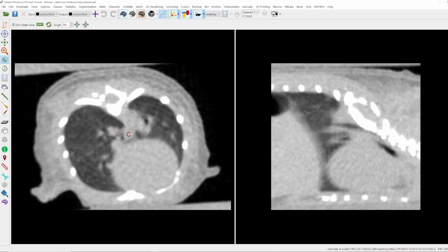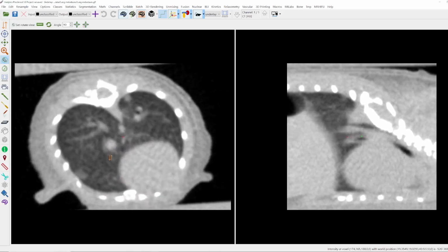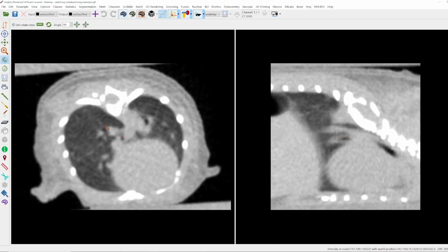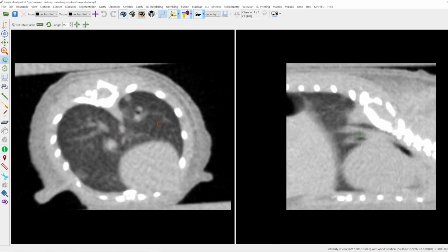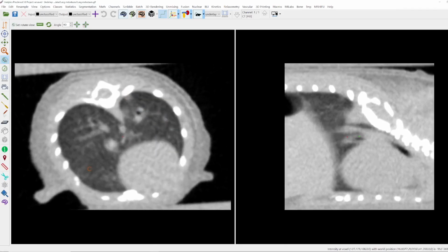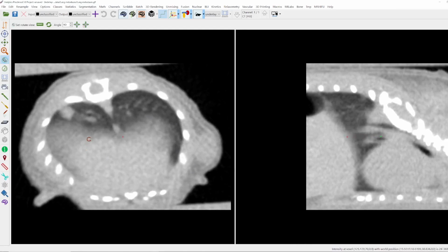And a good advice to differentiate them from the blood vessels is to go back and forth in the image, and you can see that the blood vessels, they branch, so they disappear in these slices, but the metastases, they stay. They get smaller and bigger, but they always stay at the same position. And this might help to find them.